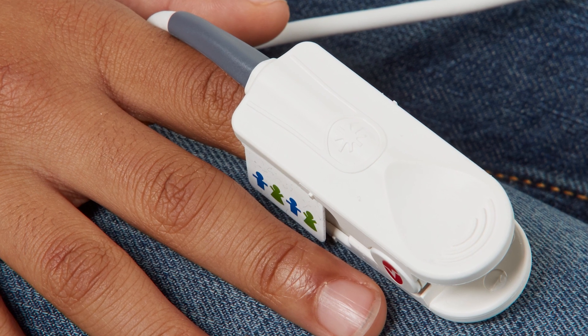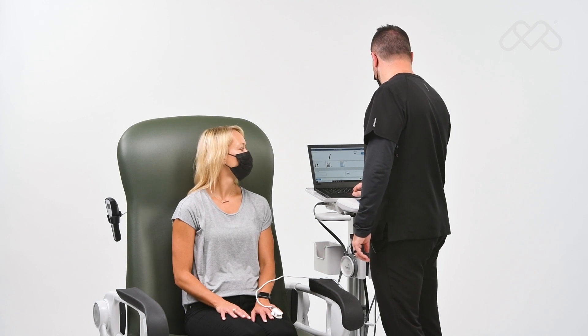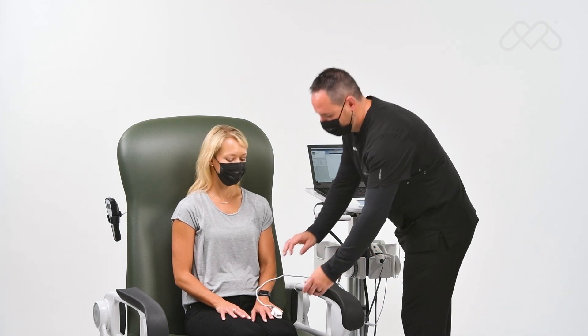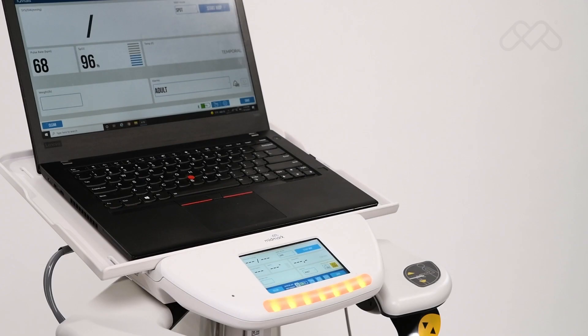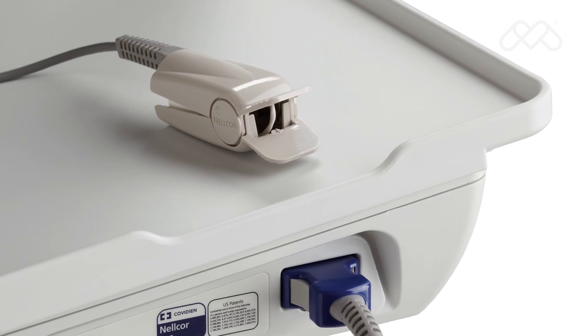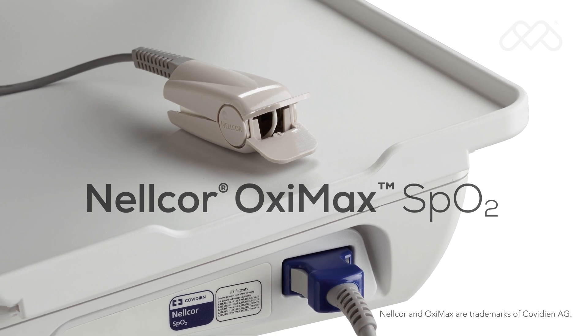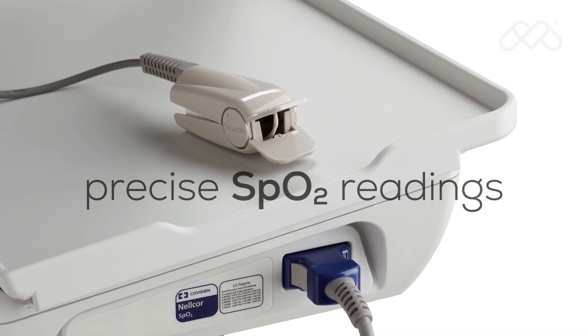The sensor is not intended for use on the thumb or across a child's hand or foot. Be sure that the patient wears the sensor until the data is saved. Once the sensor is removed, the device will alarm and the value will not stay on the screen if the patient data has not been saved.